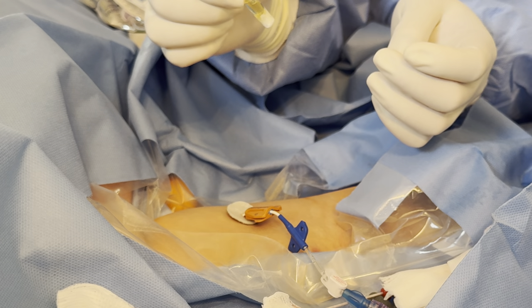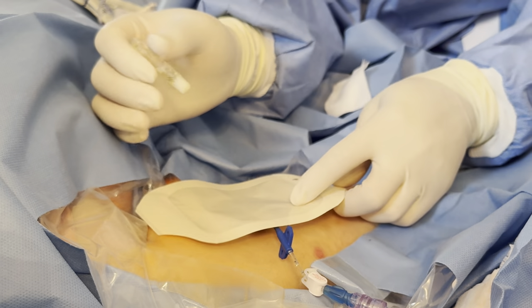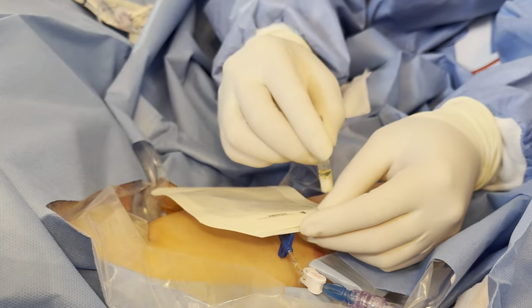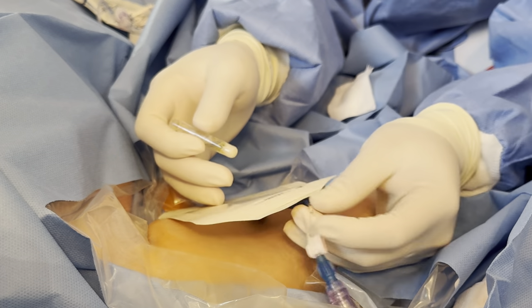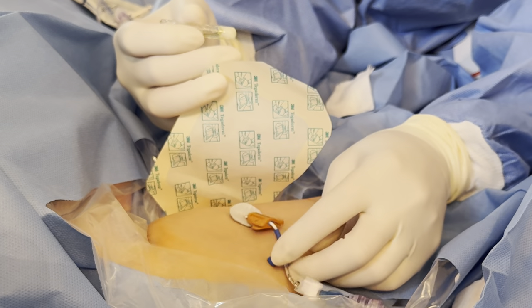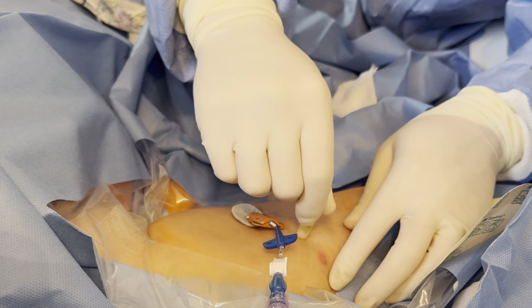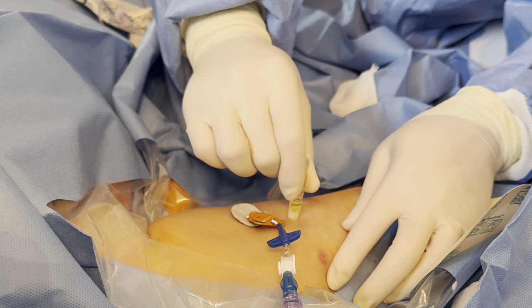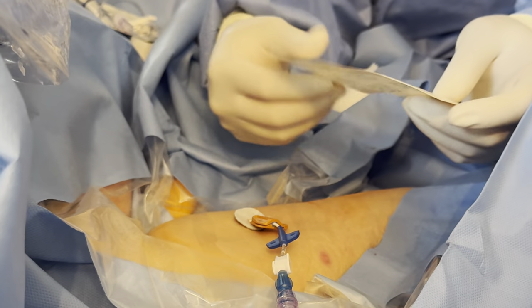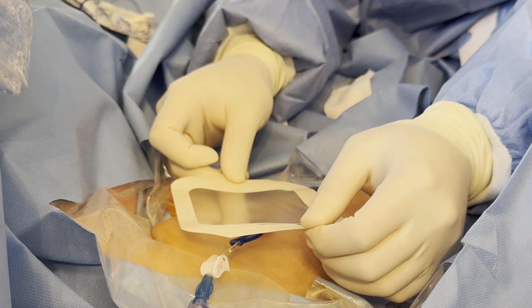Packaging is not sterile; however, the vial itself is sterile, but the chemical is not. So make sure you're not putting this at the insertion site — apply it around the dressing and at the borders. I like to crack it, then invert to let that applicator tip fill with Mastisol. So I'm going to map out the dressing — about here. We do want to cover the wings even though the SecuraCath is on. At the wing, you don't need to cake it on — just about a layer of it. We've got one line of Mastisol and we're going to tape it down all the way, covering the wings.